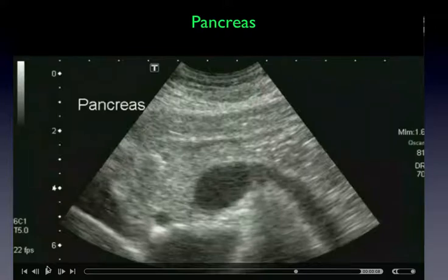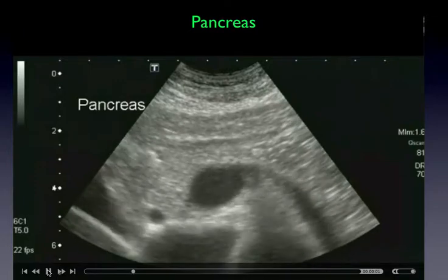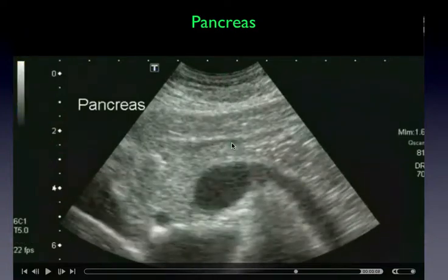And then if we go back again over here and take a look, this comes out of the plane of the pancreas over here. You can actually make out the edge of the pancreas here. So what's in this direction? We know duodenum's over here. We know spleen is over here. Up here is stomach. So this is coming from the stomach, I believe. And now we'll see, again, vascular. Well, they were thinking the duct isn't vascular, but neither is the stomach.